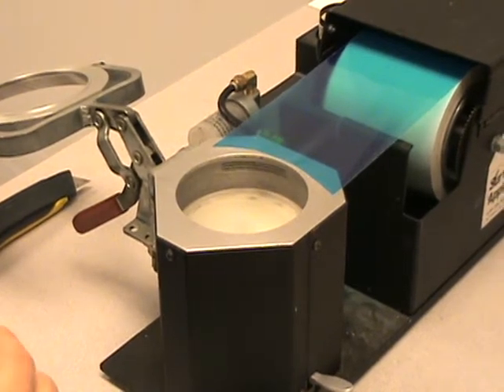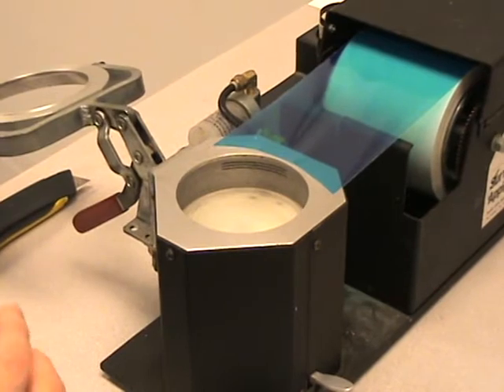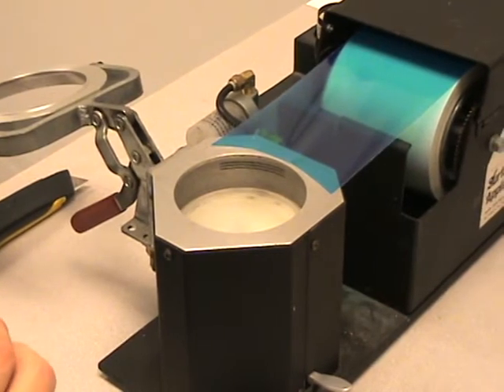Today we'll be discussing the taping procedure using the 3M surface saver applicator, which is a very common manually operated unit that we see in many labs.